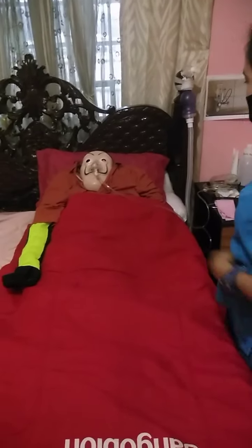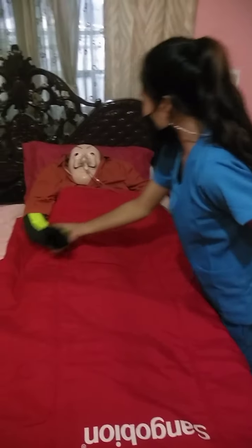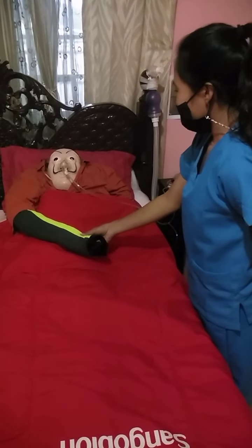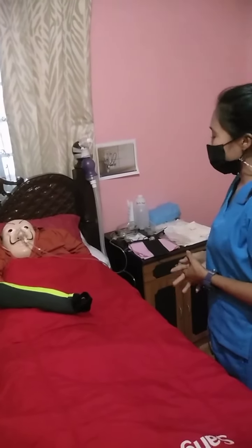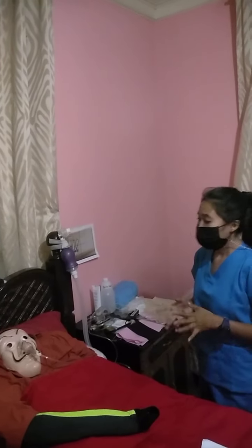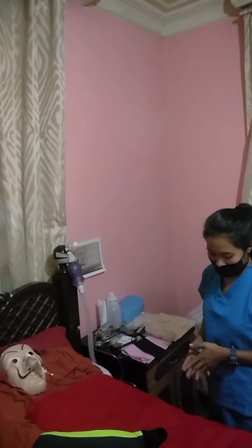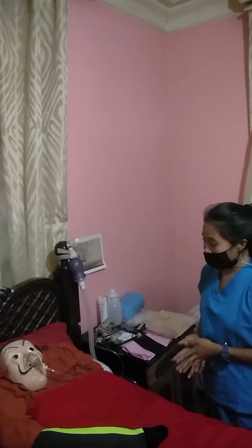Hello, ma'am. Good morning. I'm Jovi Satoheto, your healthcare provider for today. May I see your wristband, please? You can tell me your full name, ma'am, your birthday. Okay, thank you. So today, ma'am, I am going to suction your nasopharyngeal, which means I am going to suction your nose into your lungs to get out all secretions and to remove mucus and saliva from the back of your throat. Okay.